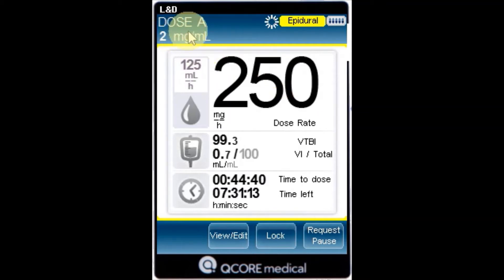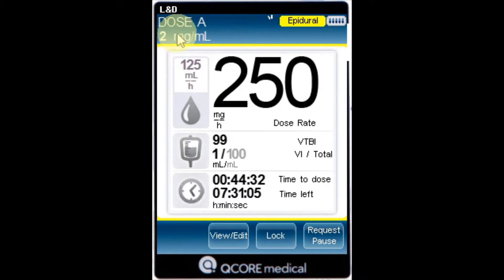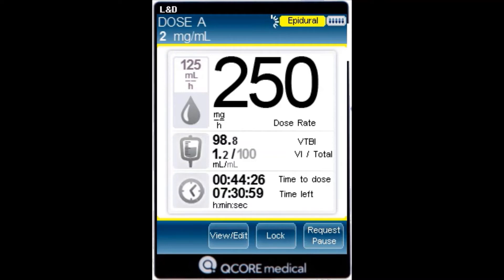In addition, the following information appears on the screen. Drug name: the name of the selected drug is displayed on the indicator bar when working with the drug library. Drug concentration: the drug concentration is entered by the user. The final concentration, or drug amount over diluent volume, is displayed when applicable.